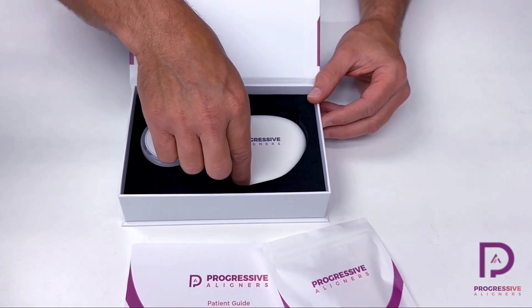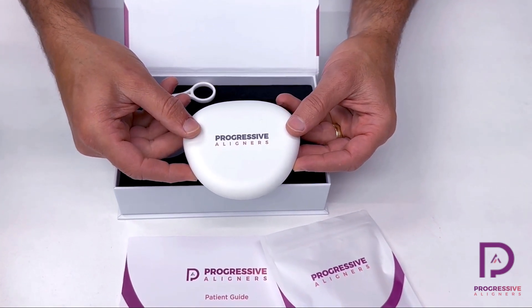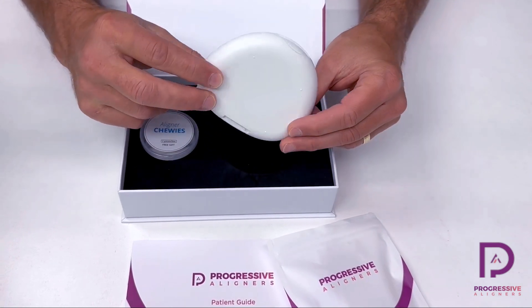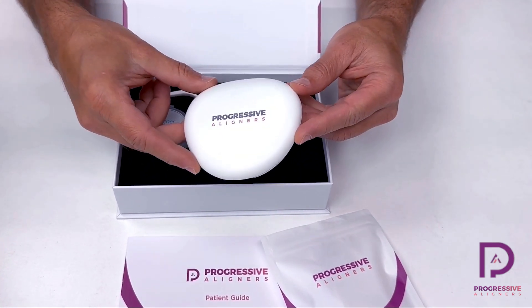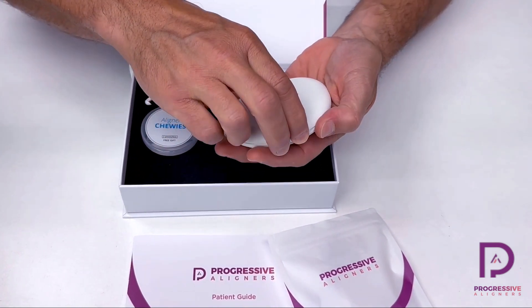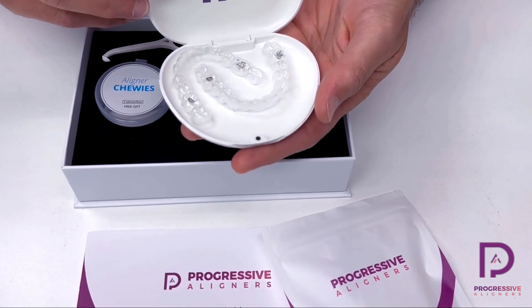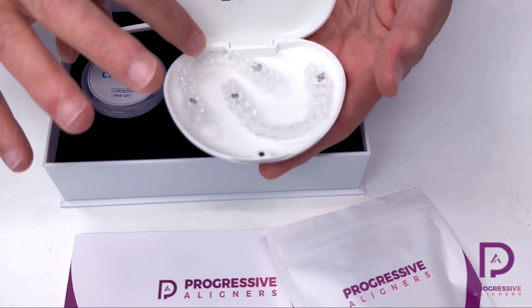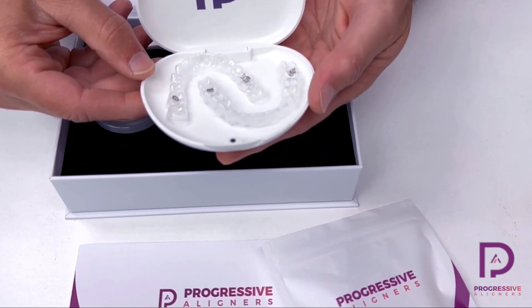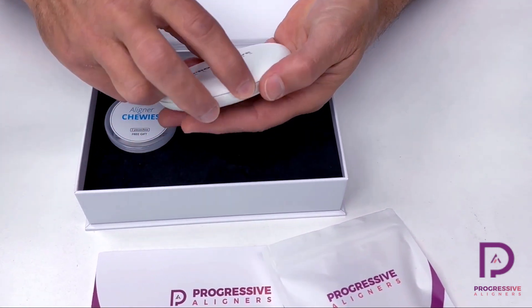Then they're going to have a very nice aligner case to carry their aligners in. They'll want to carry this case with them — put it in their pocket. It's a nice low profile case for the men to put in their pocket or carry in a bag or a purse. It's got a magnetic closed lid, easy to keep clean and hygienic. It easily holds the two aligners, upper and lower, that the patient takes out at mealtimes or to clean and brush their teeth.